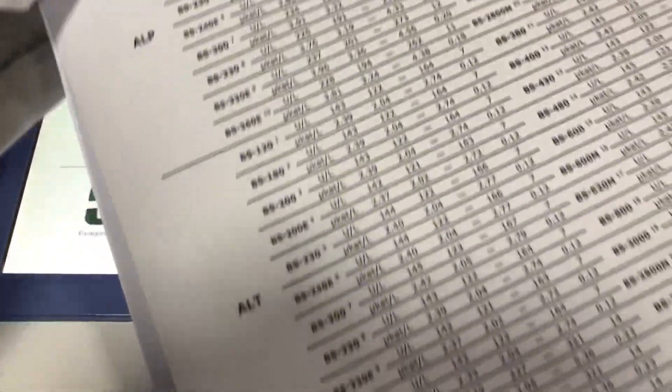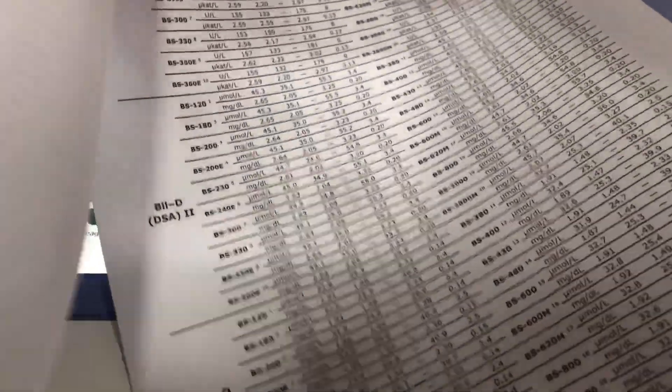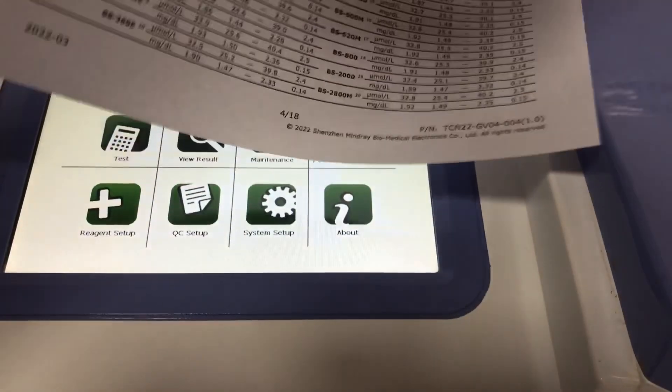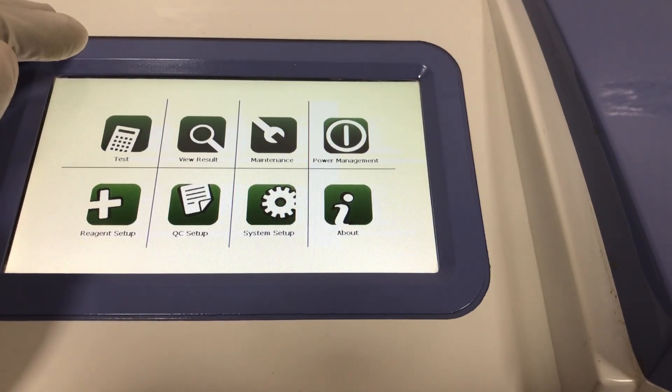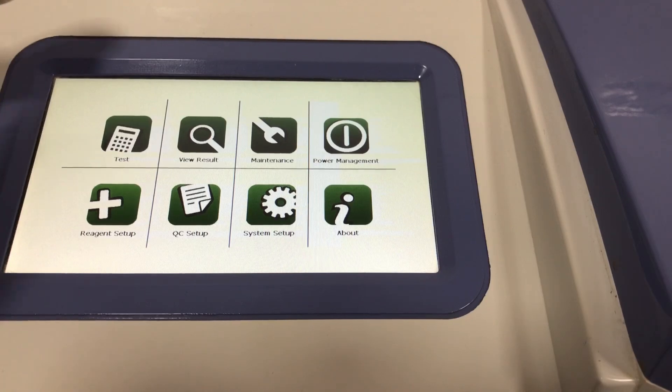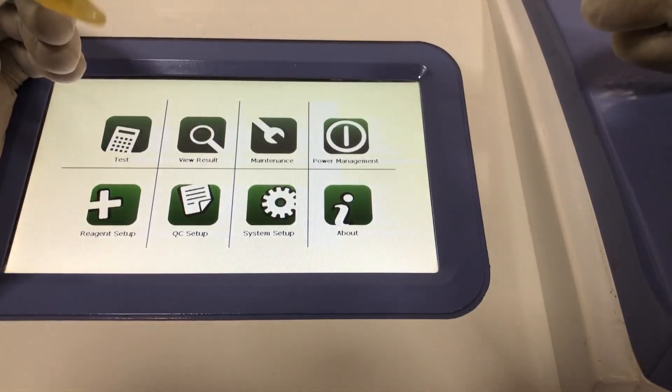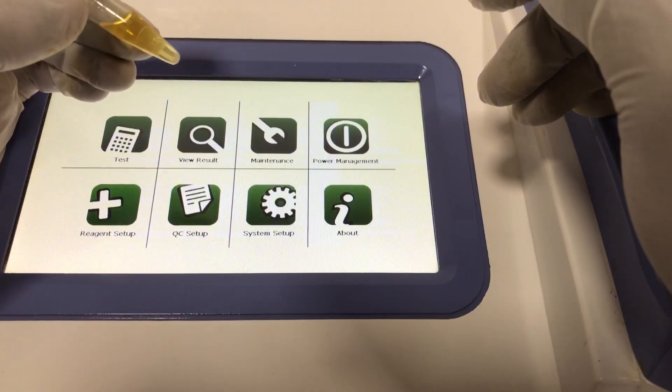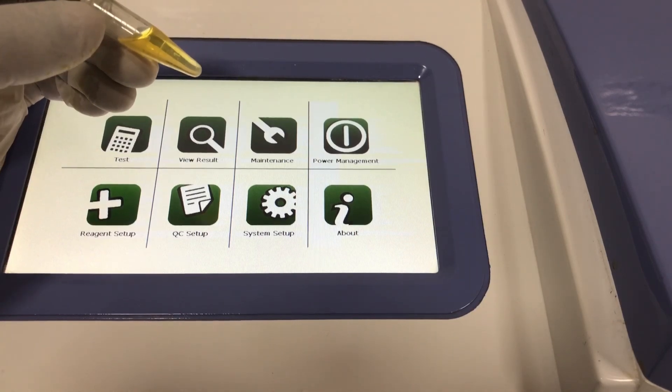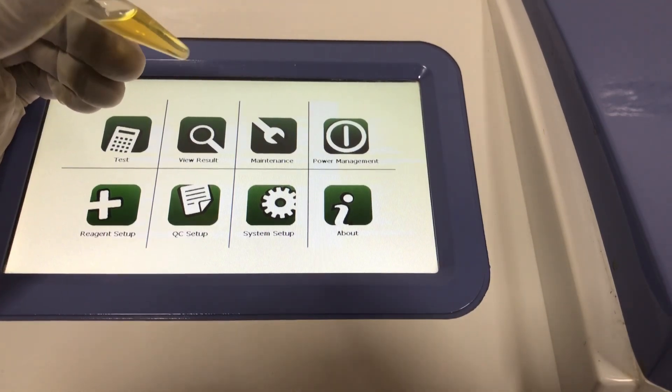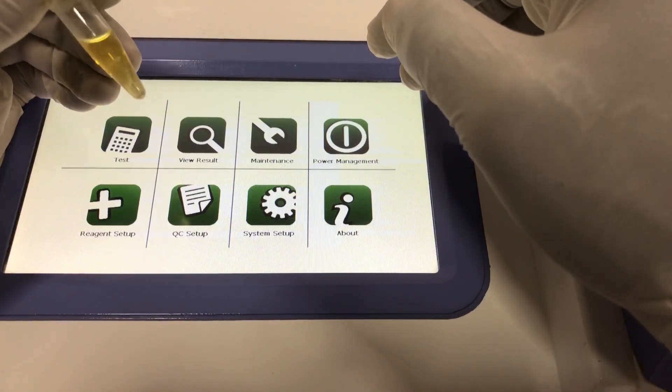We have all the analytes - ALP, ALT, it goes on. This is for AST and so on. Basically that is about quality control. This is the commercially prepared one. Sometimes you can also manufacture your own in the lab when you don't have access to the commercially made one. We'll be talking about that in part two of this video. Everything will be very practical, so stay tuned and watch out for part two.